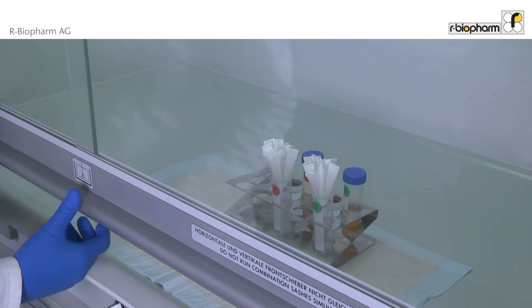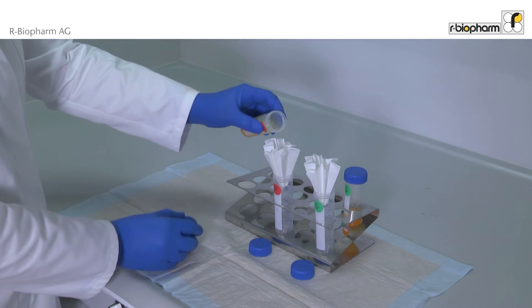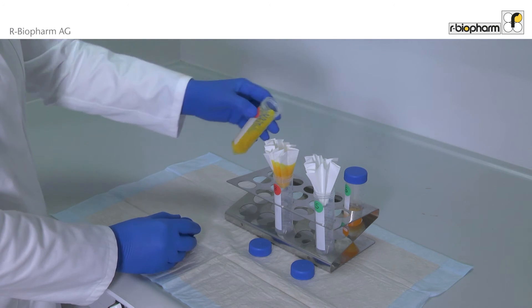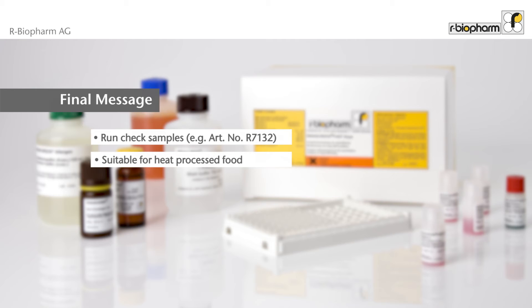Cool the sample down to at least 25 degrees Celsius. Filter the extract in the hood, then dilute the clear extract one to five with diluted AEB. Final message: use check samples.